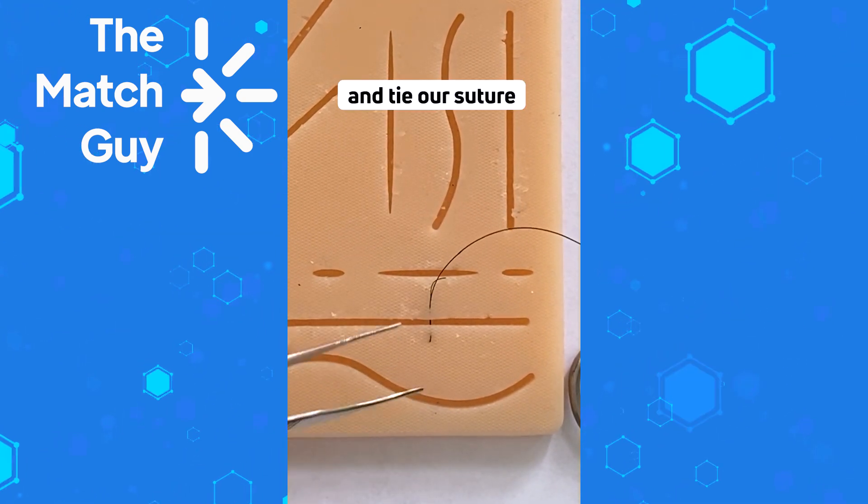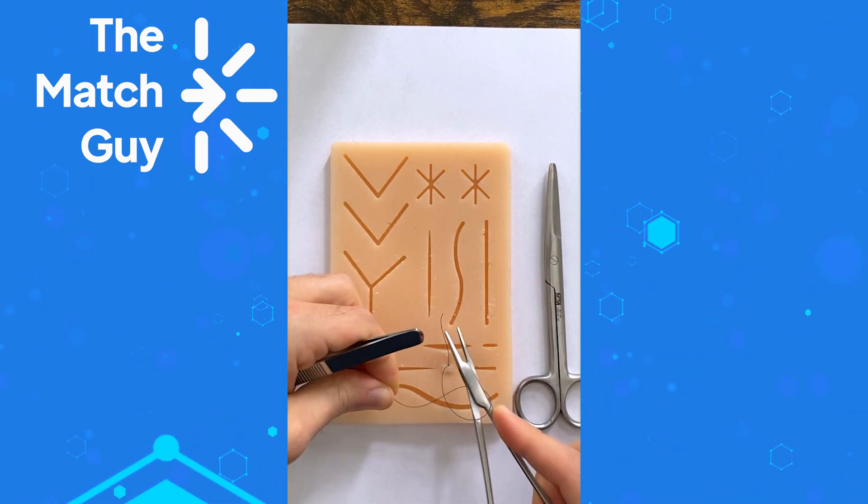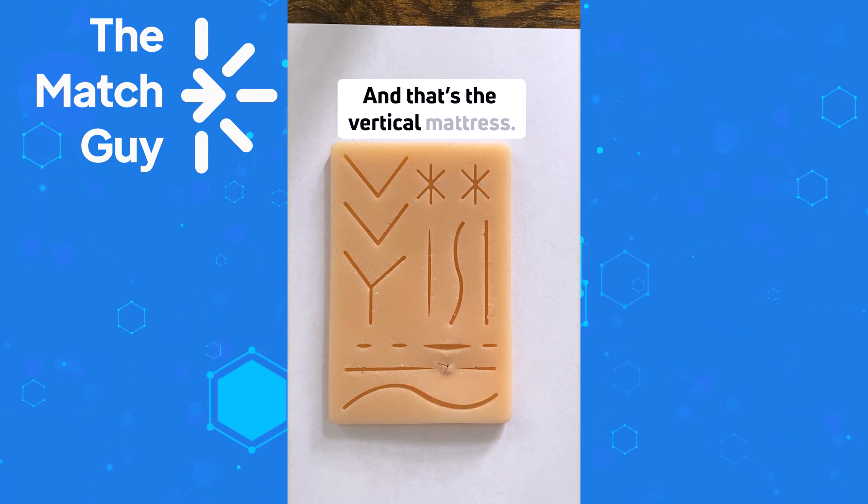Then pull the needle out, tie your suture, and cut the suture. That's the vertical mattress.